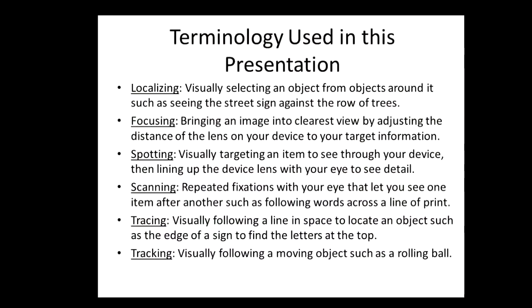This next slide presents the 6 terms that we will be discussing through this presentation. They are localizing, focusing, spotting, scanning, tracing, and tracking. They're listed here for you to refer to as needed.